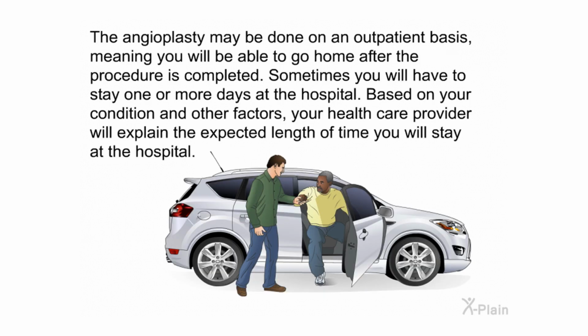The angioplasty may be done on an outpatient basis, meaning you will be able to go home after the procedure is completed. Sometimes you will have to stay 1 or more days at the hospital. Based on your condition and other factors, your healthcare provider will explain the expected length of time you will stay at the hospital.